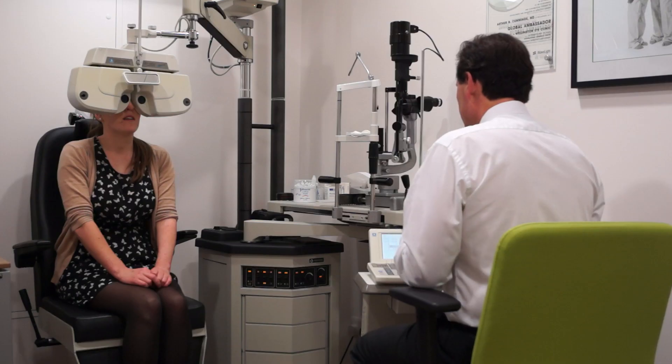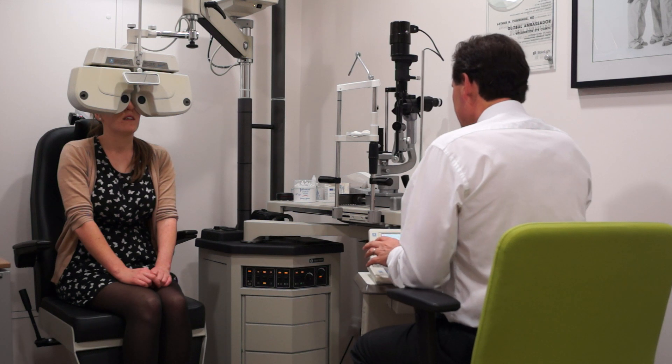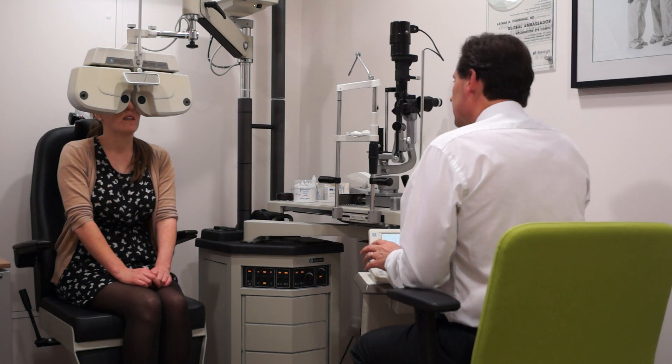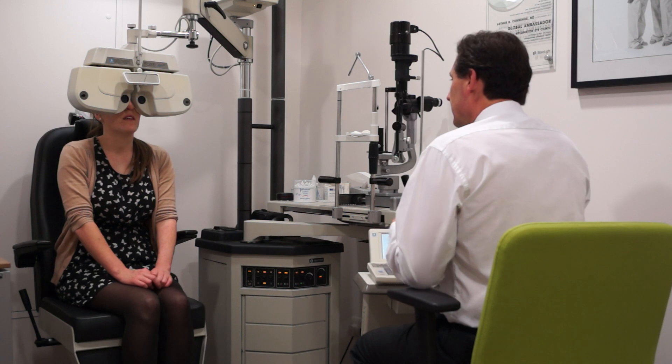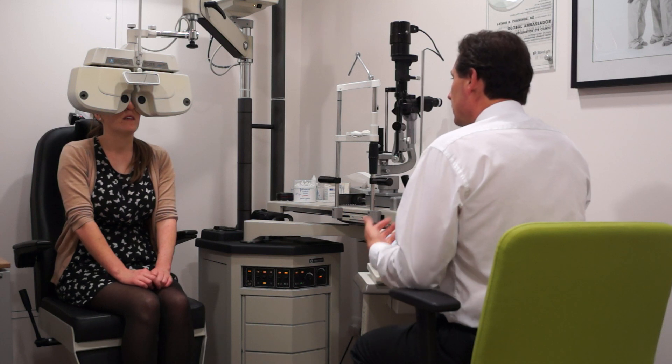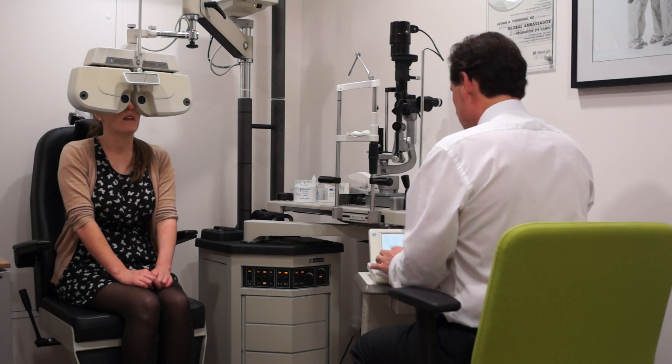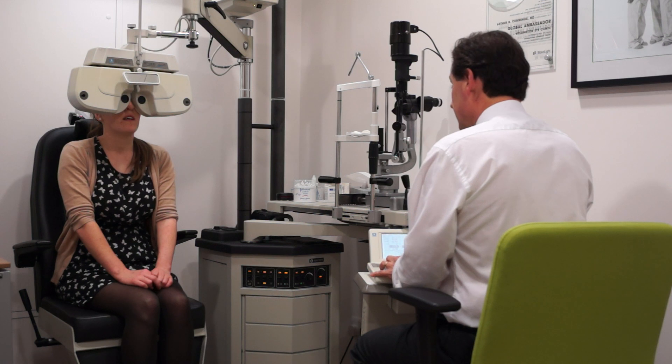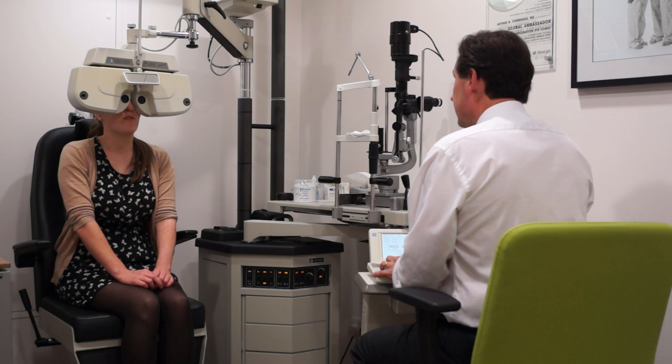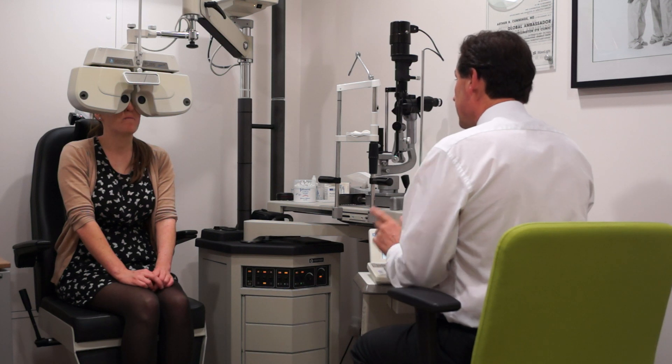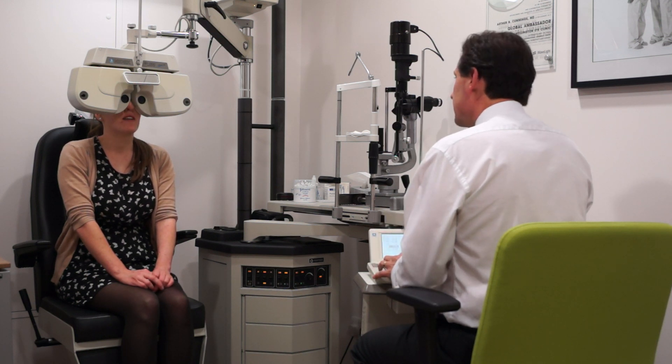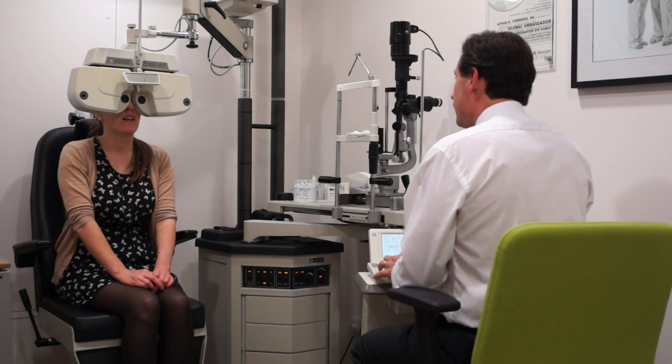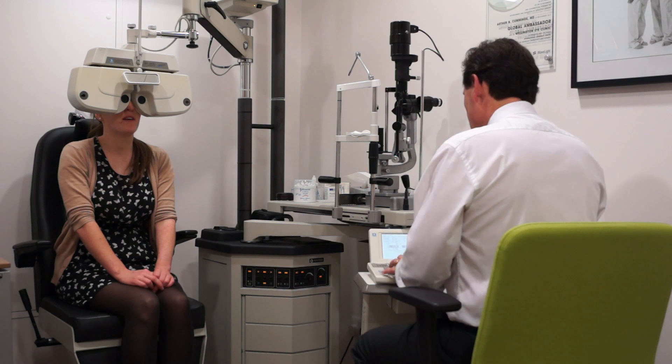And now I'm going to show you the stereo test. So what you should see now is potentially something that looks as though it's coming out towards you and isn't necessarily on the wall. Right. So what do you see out there? I see four lines that look like they're coming out from the wall. Right. Fantastic. Which one's closest to you? The one on the left. Second closest? The bottom one. Third closest? Three o'clock. Great.